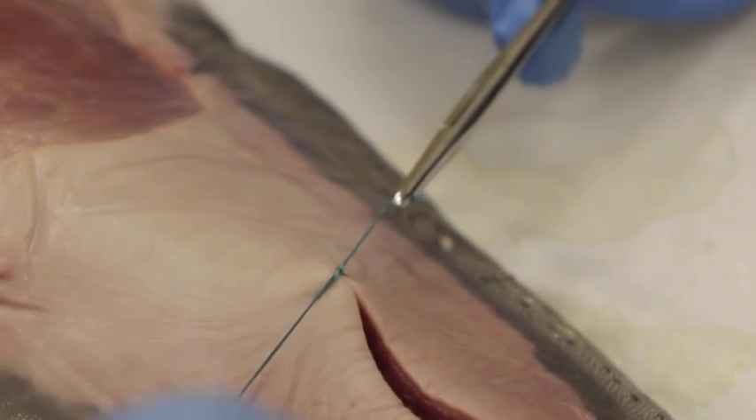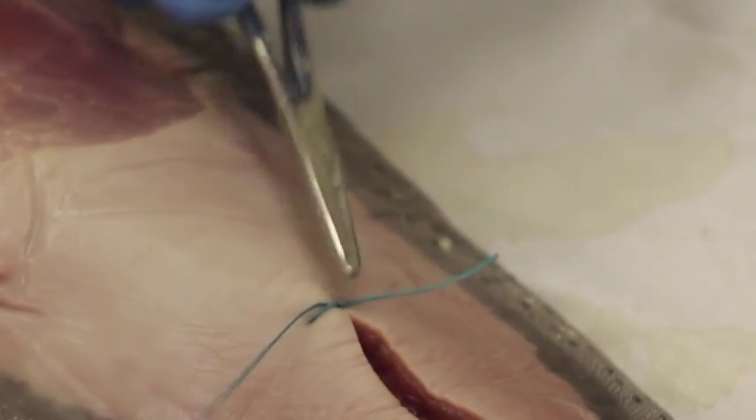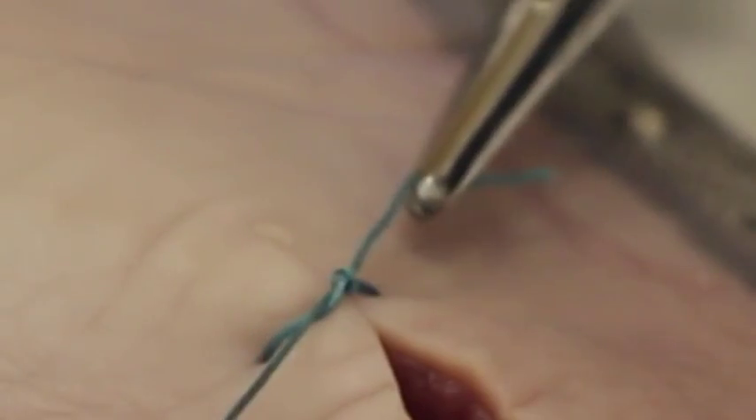Now I'm going to make it too tight — you see how this is too tight. But I want to loosen it. You see how it becomes loose now. I made it loose, and now I know I'm going to get the right tension. This is what I want the skin to be.